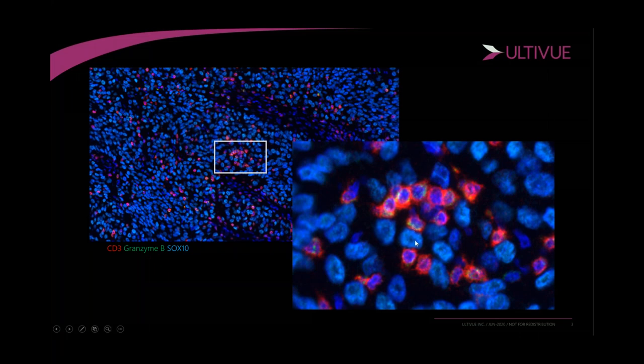And now let's look right next to its neighbor, the SOX10 cell marked by that marker. It's a melanoma cell. That membrane is also flattening right next to this flat membrane. In this screenshot of time, we can functionally say that this T cell is indeed cytotoxic, and it probably is also interacting with this SOX10 tagged tumor cell. This is the power of multiplex immunofluorescence. It's not just about identifying markers. It's about phenotyping cells spatially.